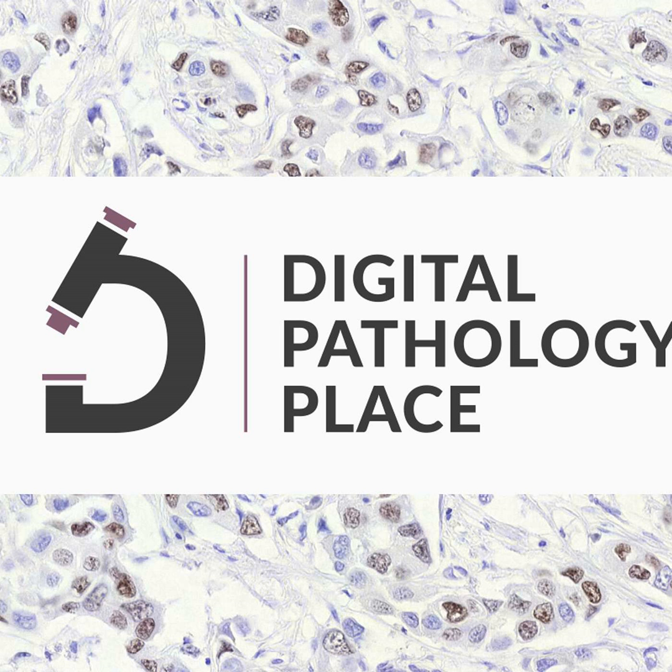So they had this U-Net for segmentation of epithelial cells in H&E, and they generated epithelial ground truths by immunohistochemistry. So they restained H&E sections with cytokeratin. So they had the same sections, which is super cool because then you don't have to guess, is it the same cell or not? You have a little bit of architectural distortion of the slide when you stain and restain. It doesn't exactly look the same because of the process it goes through, but it's close enough. Better even than serial sections. And then combined it with pathologist annotations.